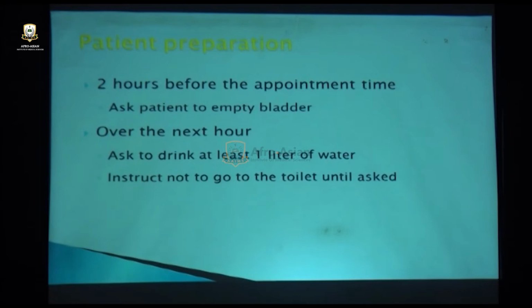Patient preparation is again very important. What you tell your patient is that 2 hours before the appointment time, empty the bladder. And over the next 1 hour before the examination, you ask the patient to drink 1 liter of water. If you tell her to hold her urine and come, by the time she gets to you, she will have too much volume in the bladder, and the poor thing will be troubled, and it will be very uncomfortable for you too while scanning.